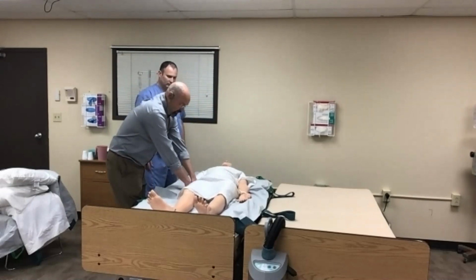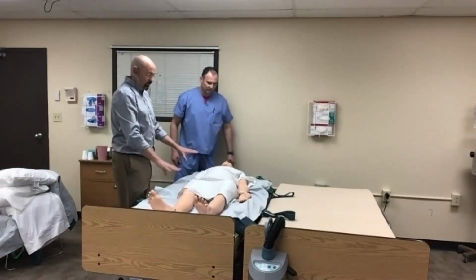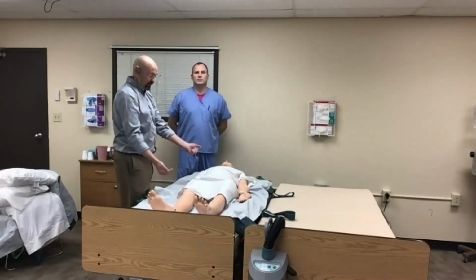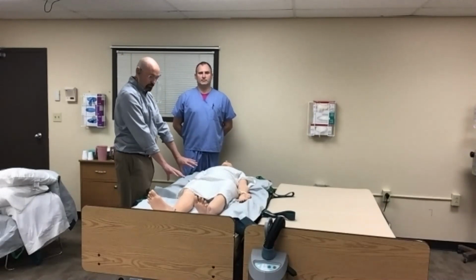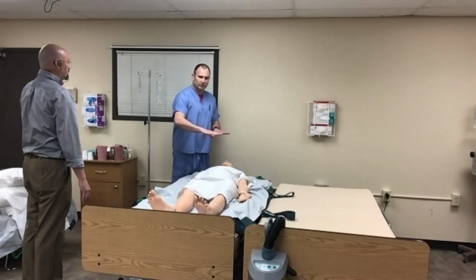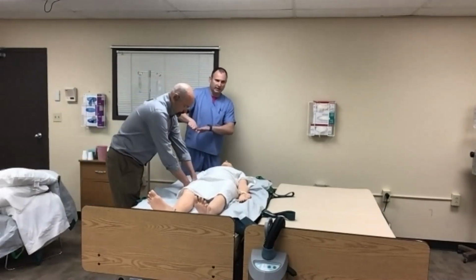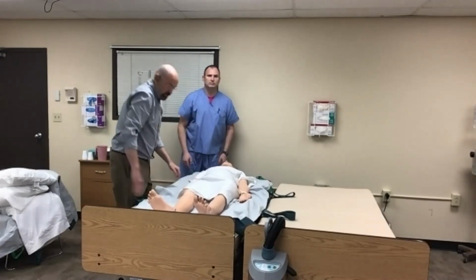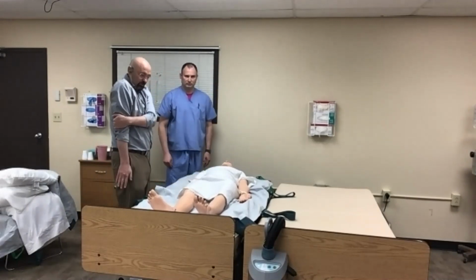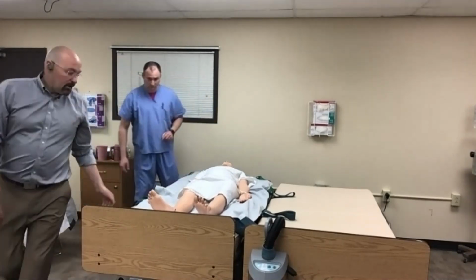In this scenario, this will lock everything in place, so when he proned onto this surface, we don't have any issues with the arm getting stuck, and we don't have any issues with the tubing pulling out. Just to review that again, it's under the patient, under the arm, around the arm, and then back under the patient. So literally we'll take that arm and attach it right next to the body.